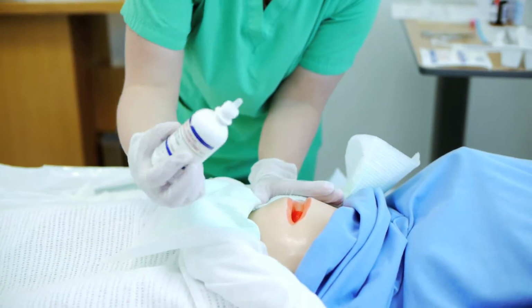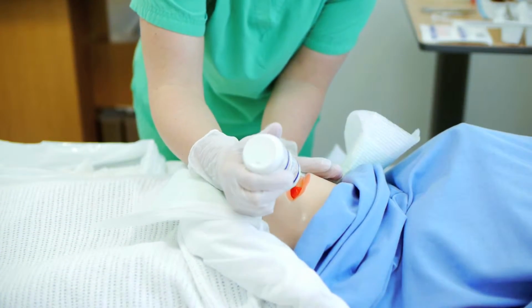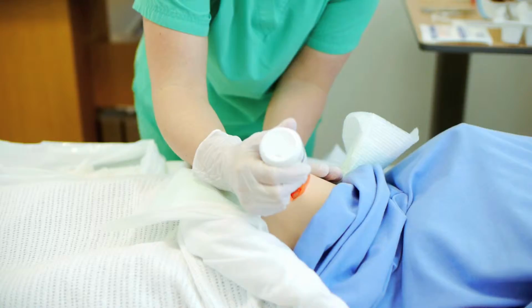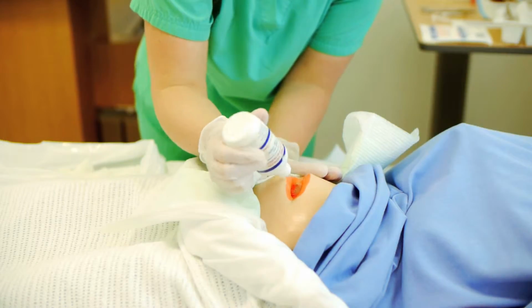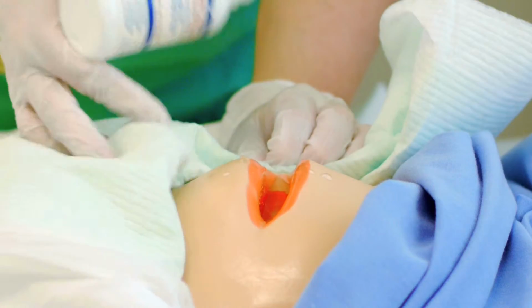So to start, we're going to cleanse your wound. The purpose behind irrigating a wound is to stimulate the granulation tissue to form and to remove any non-viable tissue or bacteria from the surface of the wound.